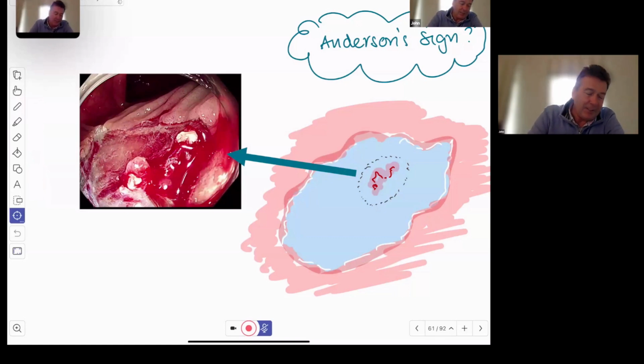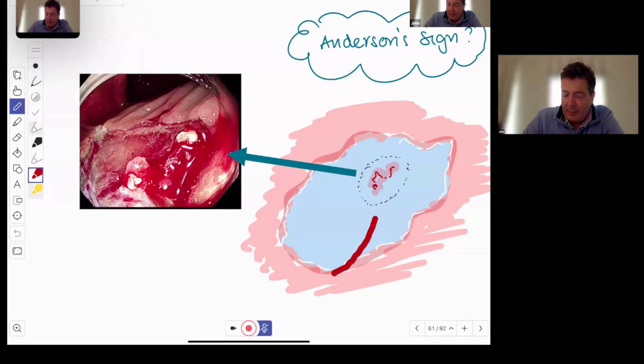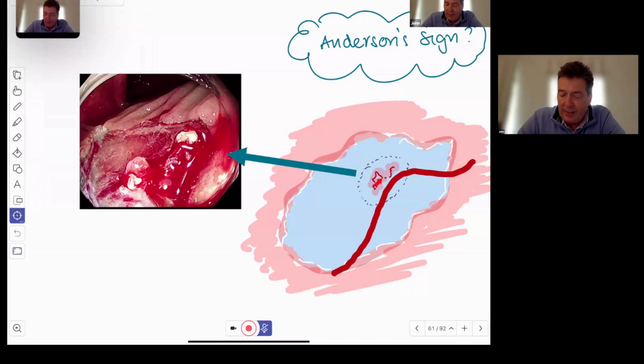And I said, this is a great example of Anderson sign. And I have an increasing belief that what happens is you get blood supply coming up. And at some point in time, if the polyp has become malignant and changes, you're going to get some form of adhesion molecule or molecular change.